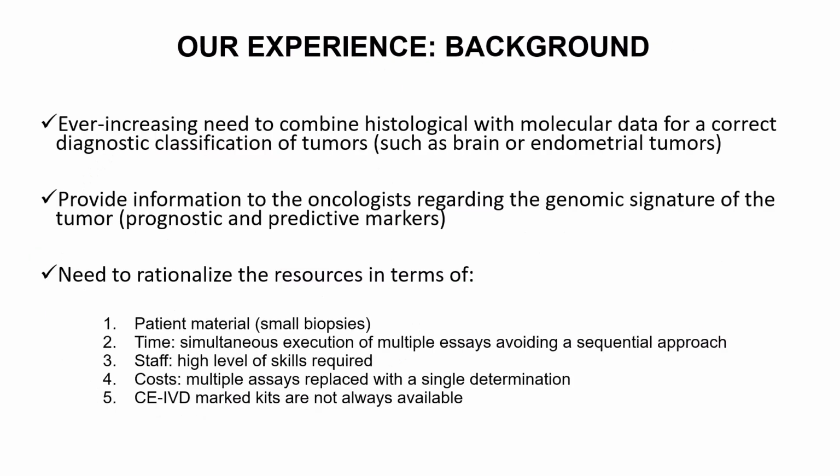To keep up with the times and ensure high standards of patient health care, we have decided to implement next-generation sequencing into our routine practices. Specifically, this decision is driven by several factors. An ever-increasing need to combine histological with molecular data for accurate diagnostic classification of tumors, for example, brain tumors or endometrial cancers. In fact, integrating NGS allows us to supplement traditional histological assessment with comprehensive molecular profiling. This combined approach enhances our ability to classify tumors more precisely, leading to more targeted and effective treatment strategies.